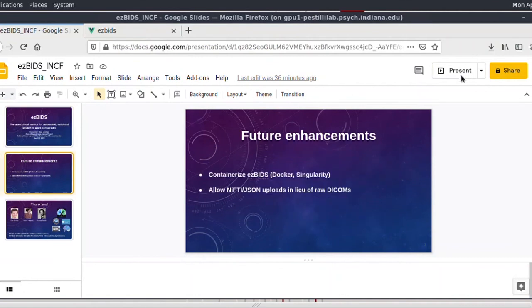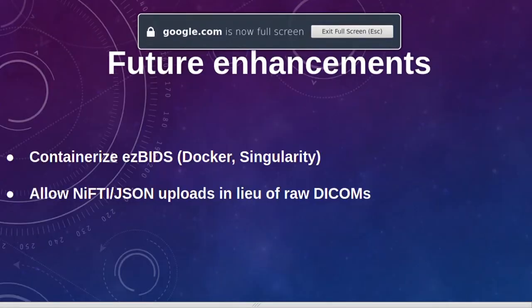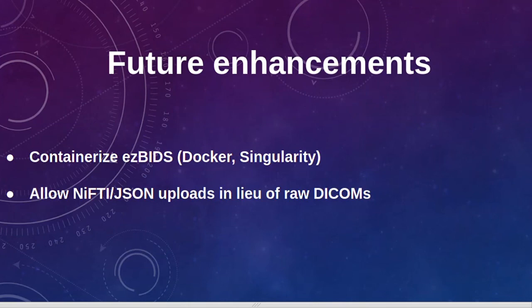All right, so I do want to quickly touch on some future enhancements that we are planning to do with ezBIDS. One is that we want to containerize ezBIDS into a Docker container and a Singularity container, so that you could run this locally on a web browser. That's a future enhancement that we're looking to make.